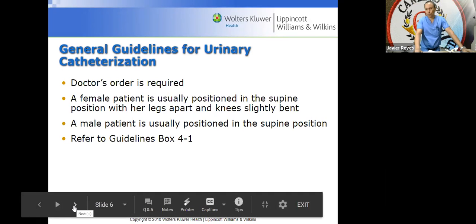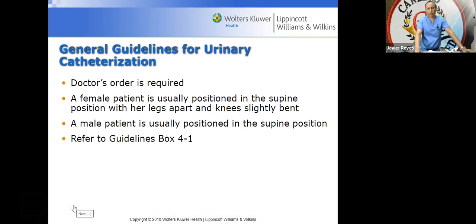There are some patients that after having catheters for too long, and they tug on them, they pull on them a lot, actually start to get what we call meatal tears. The meatus, the opening in the male, starts to tear and it starts to come down in this way. It looks pretty nasty, but that's another complication.